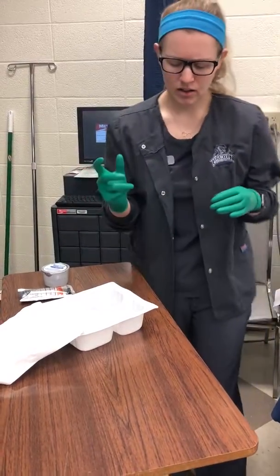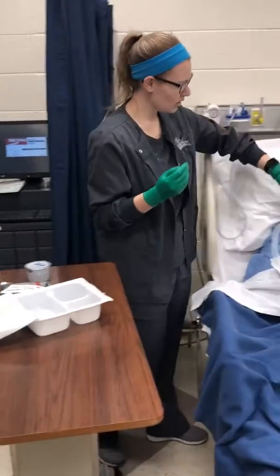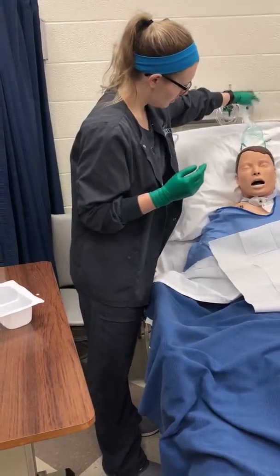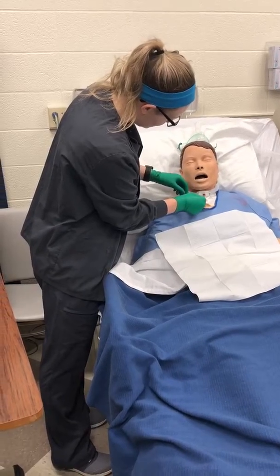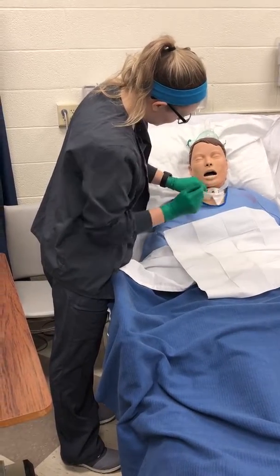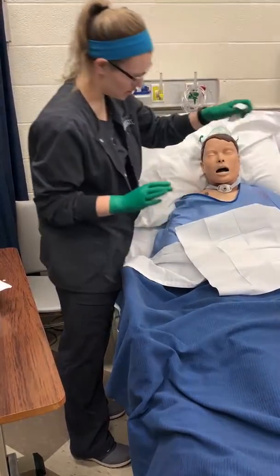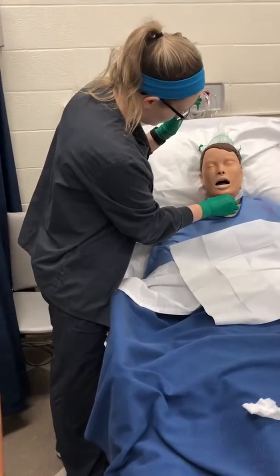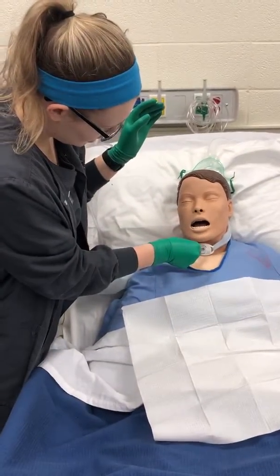So then we're going to, once again, take the oxygen off. And then take off this dressing, keeping this hand sterile. I would only touch the dressing with this hand. So then I would grab and take the trach out.